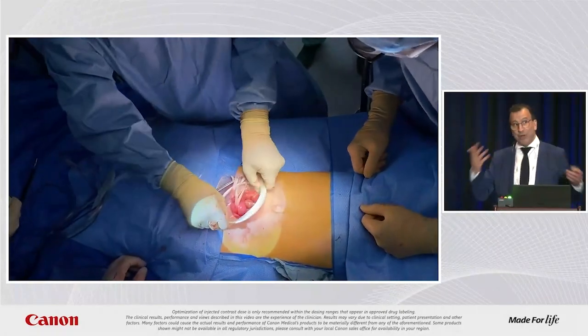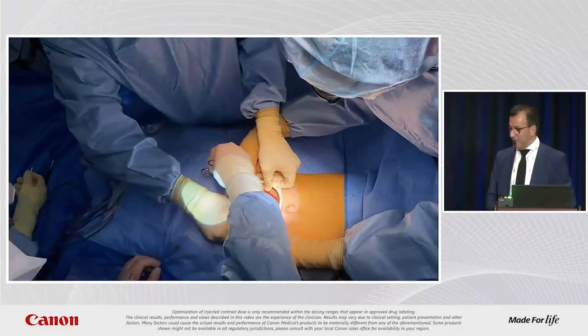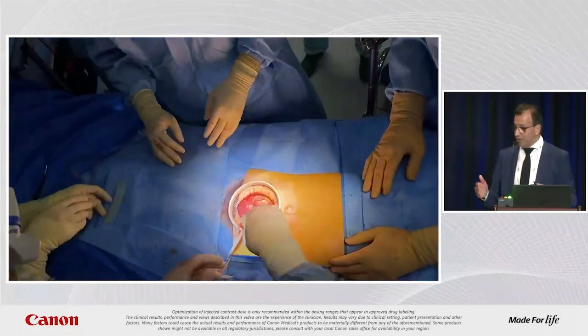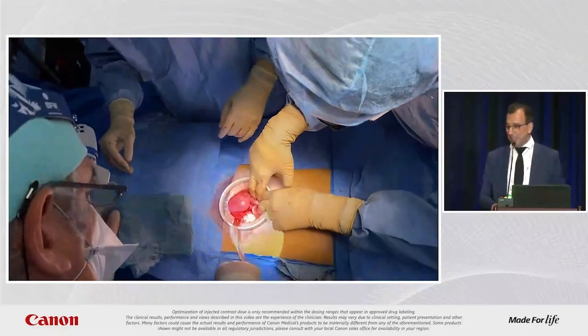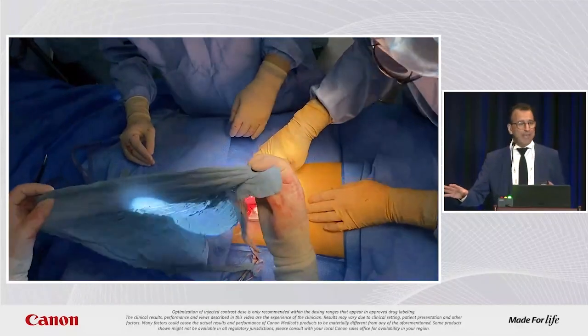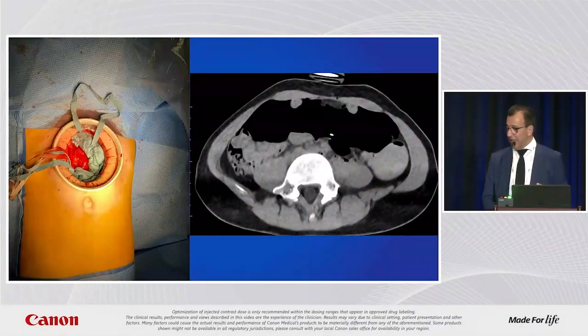I wash and shower every morning, but this is it. And here you are, at this moment, they open up and they leave the room. You are alone and you are beginning, and now they put all the gas to remove everything. So you have a direct access to the tumor like this. They take their time. All this part takes about 45 minutes. For them, it is quite fast, and they like to work with us.